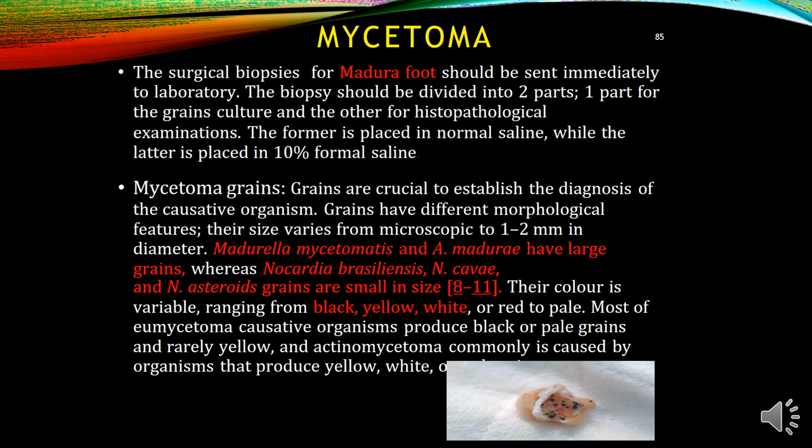Biosafety. The surgical biopsy of mycetoma foot should be sent to the laboratory immediately. The biopsy should be divided into 2 parts, one part for the grains and the second part for the histopathological examination. The former is placed in normal saline while the latter is placed in 10% formalin saline.